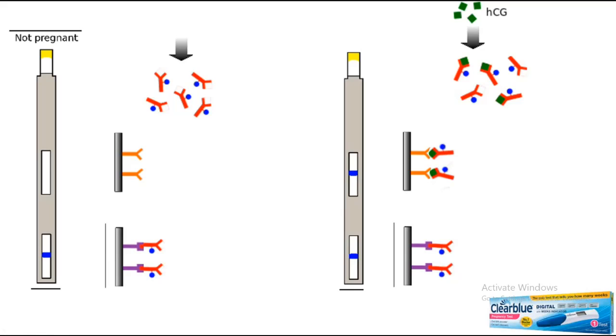So in this case, the detection antibody, in this case, the individual is pregnant.